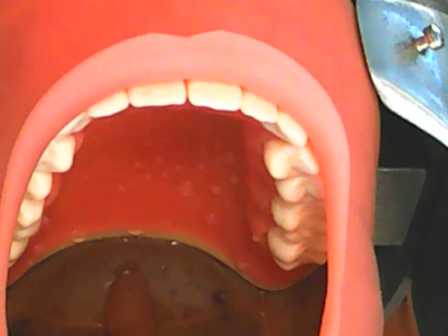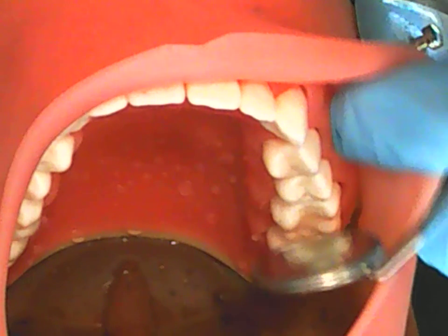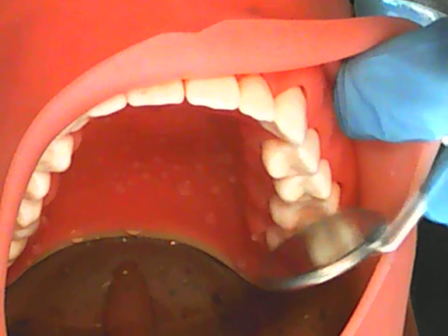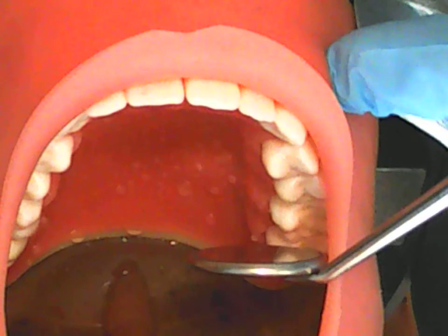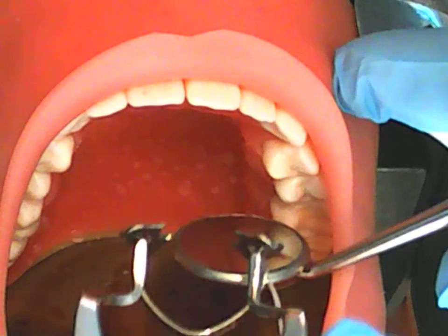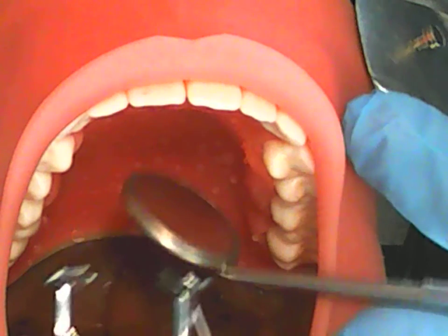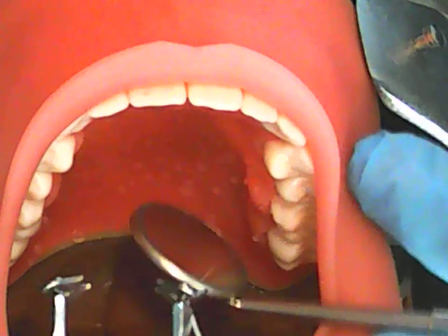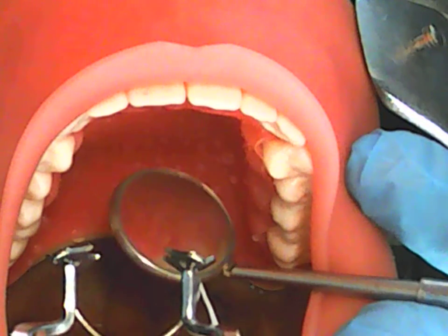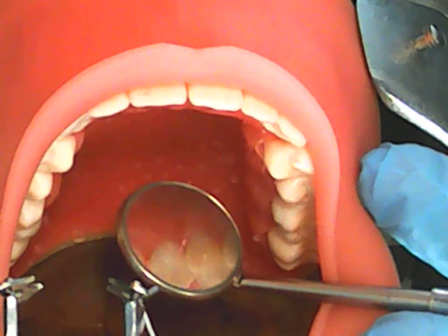Using indirect vision, you will introduce your mirror. I like retracting the cheek with my finger to facilitate my vision. You don't need to do that; you can just fulcrum on the cheek if that works for you. Just trying to get the tooth in the mirror for all my viewers. Kind of see what I'm doing.